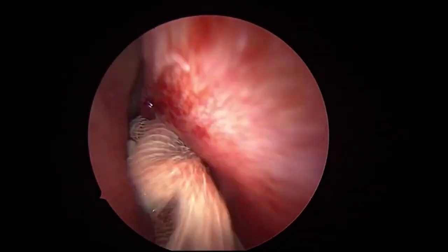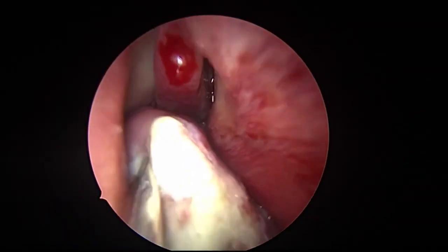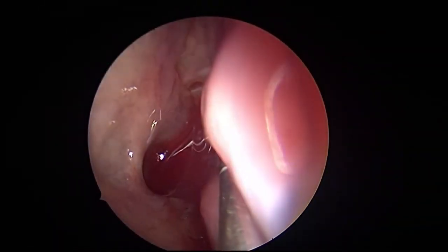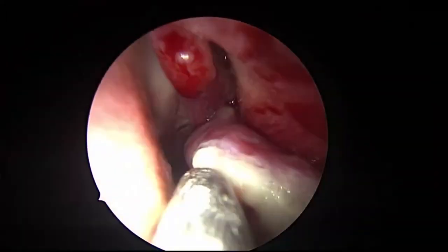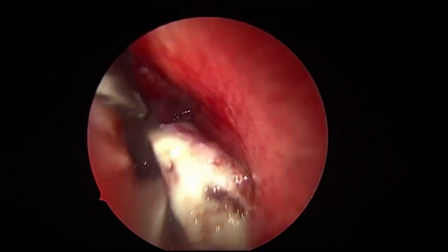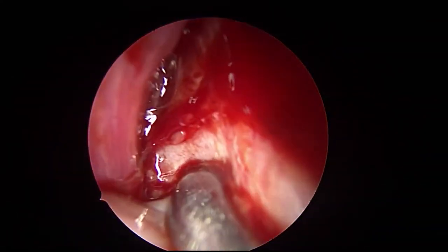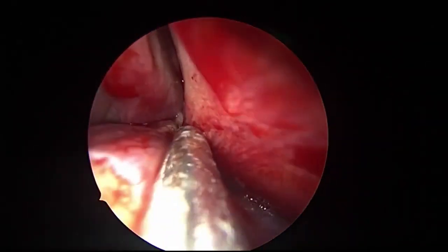See the peculiar thing about this anterior extension in this tumor. See, this is how it is pushing the lateral wall. The lateral wall of the nose, or the medial wall of the maxilla, is pushed laterally by the tumor mass which is coming anteriorly. And this is coming from here, just behind the middle turbinate, from the pterygopalatine fossa. Could you see?